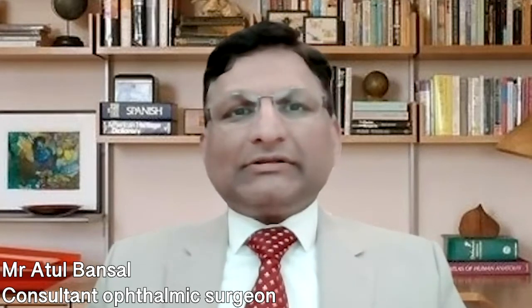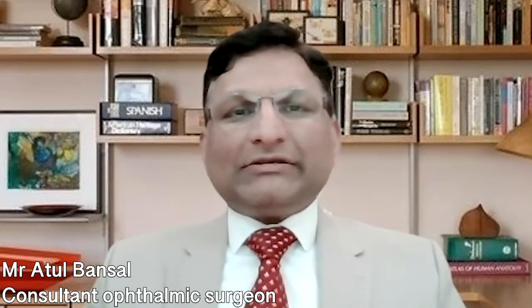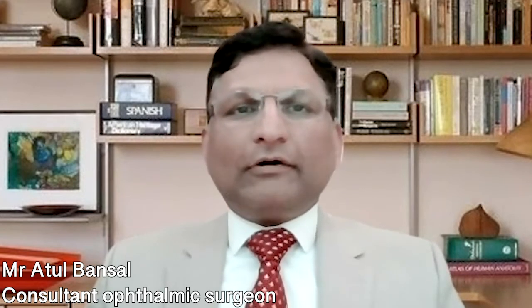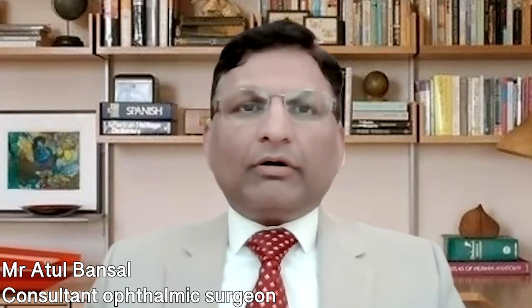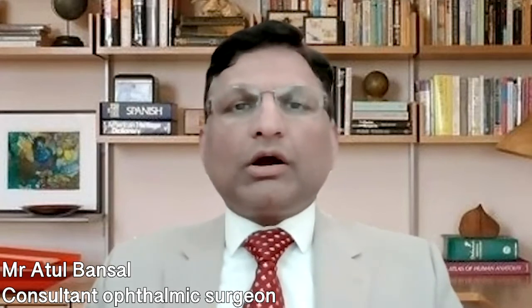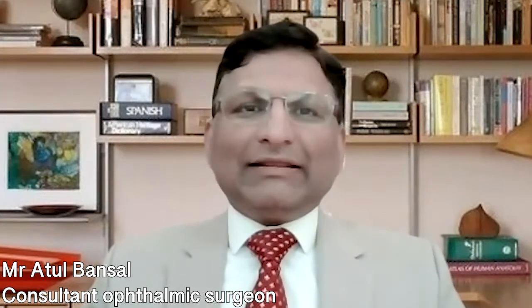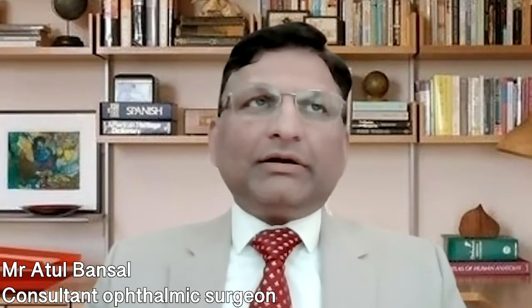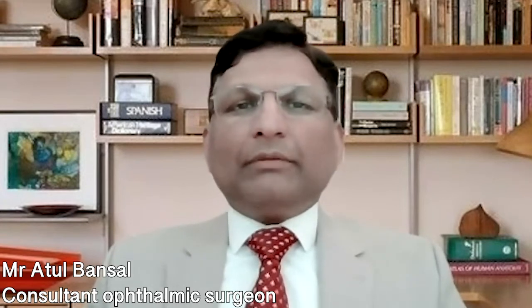The third type is the cyclodiode laser, which is usually used either in cases where other standard forms of laser or surgical intervention are not working or have failed, or in some cases for patients who can't have bigger surgery because of their general health condition or ability to cope with follow-ups. It is done in theater rather than outpatients. It's a very short procedure as well and can help reduce the pressure, but it's usually considered after other less invasive procedures are tried.